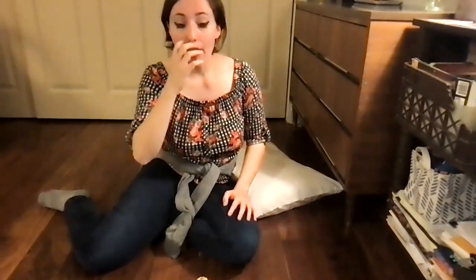At that point, shock is ready to be given. There's a button on the AED that you'll press that says shock or administer shock or something like that. It's usually yellow, with a little lightning bolt on it. At that point, you want to make sure that nobody is touching the patient. You want to make sure that the patient is not wet, that they're not in a puddle of water, and that you're not in the same puddle of water that they might be in.